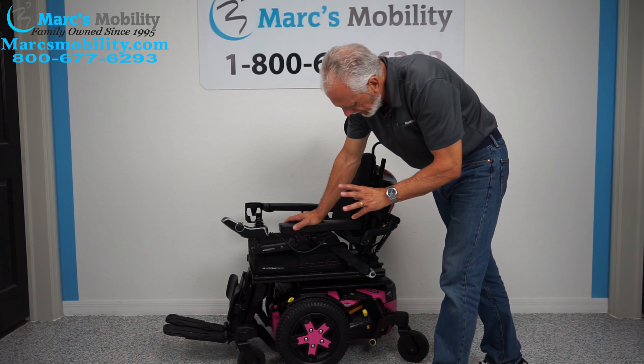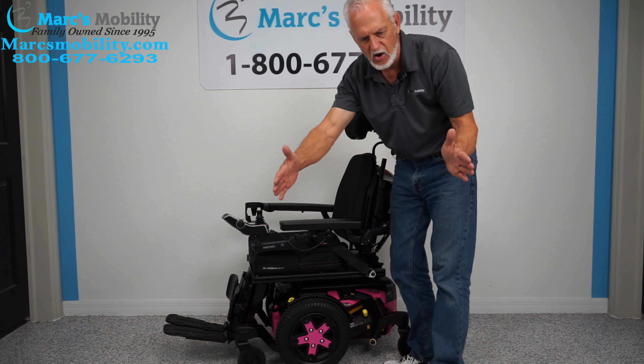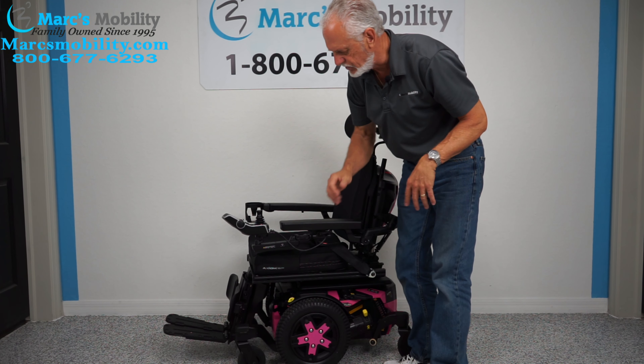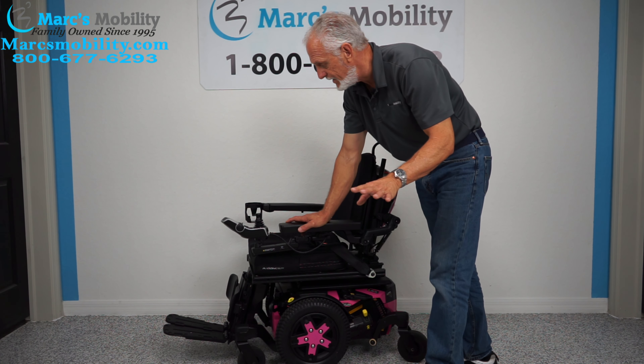This is an Edge 3 Stretto — that's the smaller version. It's only 22 inches wide, from wheel to outside of wheel. This chair has 12 miles on it; it was used for less than a month.